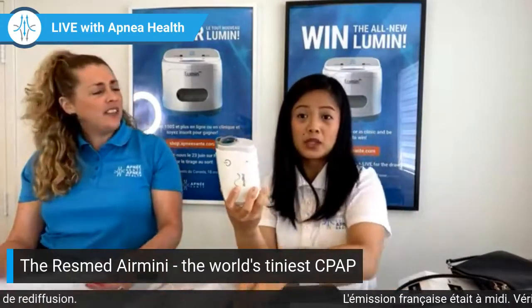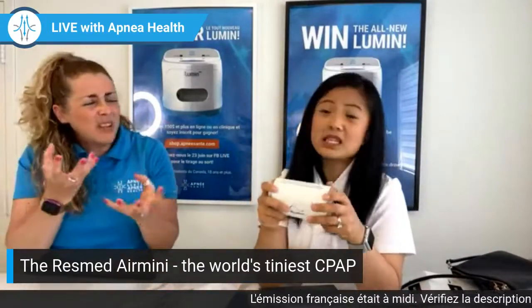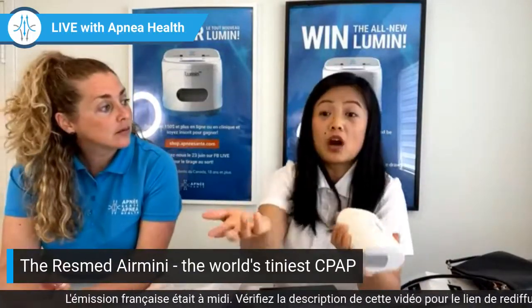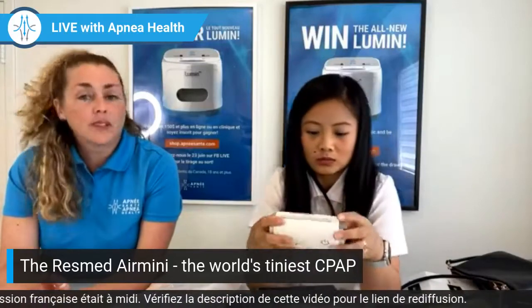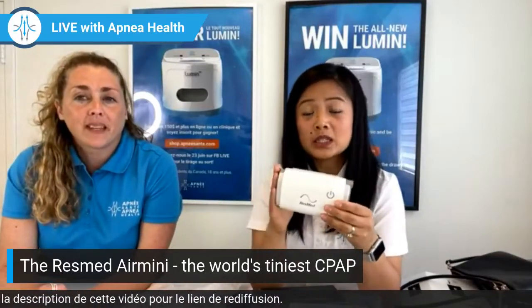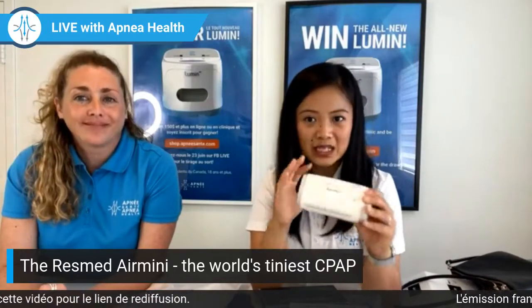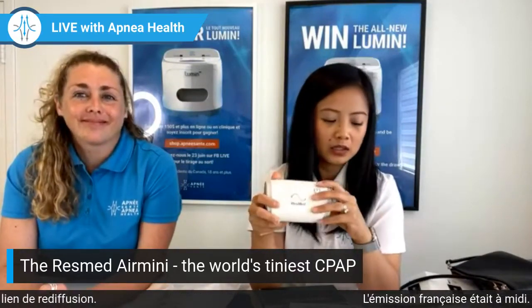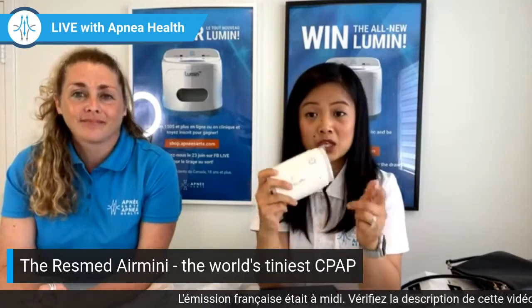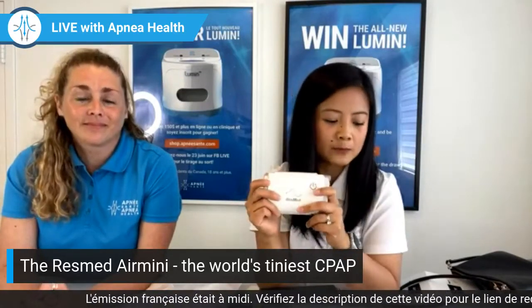Airmini. And I think it's also what patients really tell us about this. Yes, and these are real, and we're being honest, these are true by experience also. So one, the fact that you're limited to 5 masks. For me, if you're not already a user of any of those 5 masks, you will have to go through an adaptation period to get used to those masks.